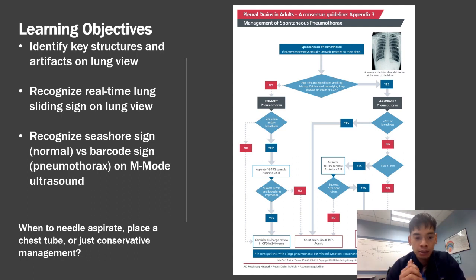And all of this is to say that we can intervene if necessary, and this is beyond the scope of this curriculum. But you can use this real-time data to say, do we need to tap it? Do we need to let the air out? Do we need to aspirate it with a needle decompression? Or will this spontaneously resolve on its own, okay? So these are real implications after we learn the basics.